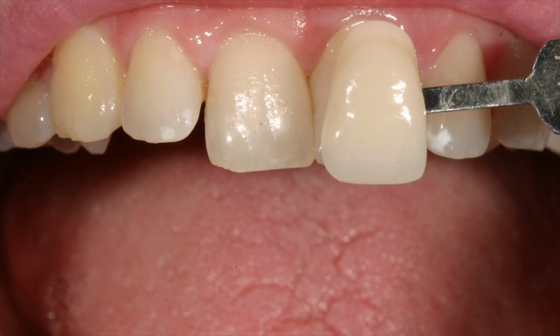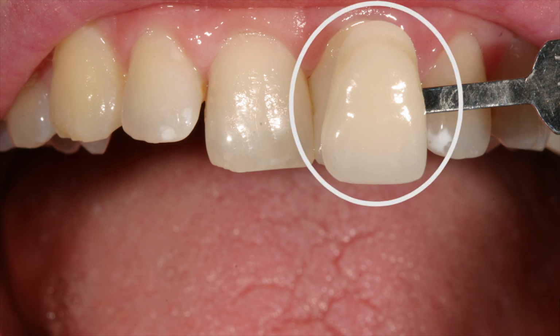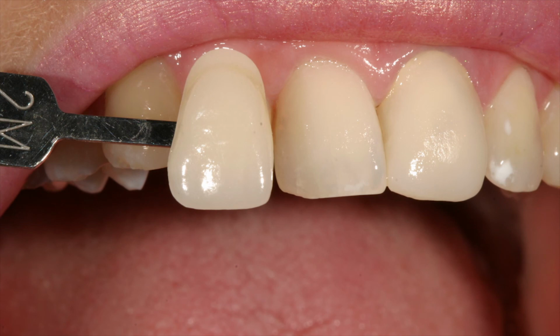Here's a common mistake that happens quite often, is the shade tab's out in front of the tooth. Now look at what it does and see how it casts a shadow on the natural tooth that we're actually trying to match. So we talked about value being the most important element of shade taking. Obviously, by casting a shadow from the shade tab, it's going to lower the value of that natural tooth. So therefore, your shade tab is going to look higher in value, and the tooth is going to look lower in value. Again, that's why we like to see the shade tab down below and in front. There's another reference of a photo, same thing, where we cast a shadow on it.